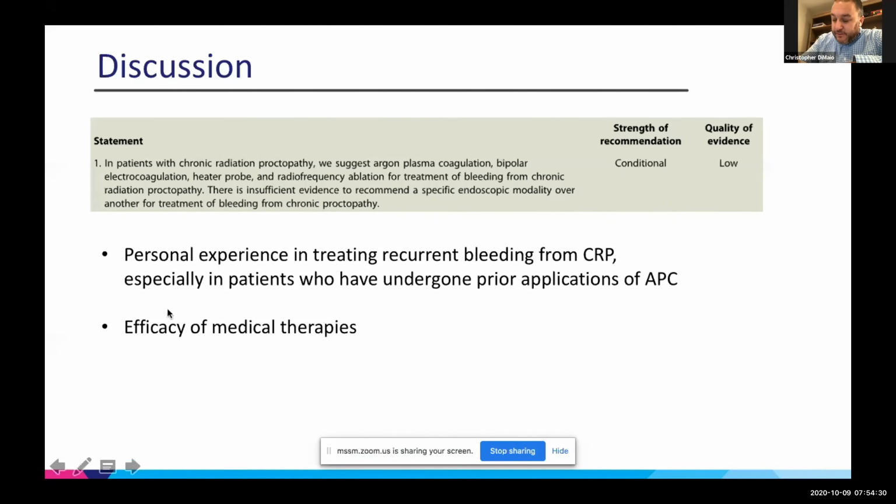Hi, Jerry. At the beginning, I was the only one who had an APC in this tri-state area. And there were a lot of patients having bleeding from radiation proctopathy, and I was able to treat a lot of patients. So I had a tremendous experience with using APC. I caution one thing though. One day, a patient was transferred to my office from Brooklyn with severe bleeding from what was thought to be radiation proctopathy. 6 guys brought him into my office, and he was obtunded.